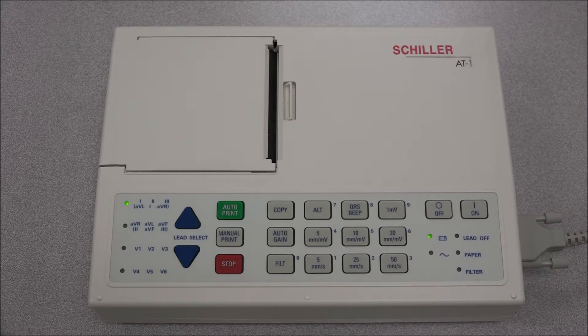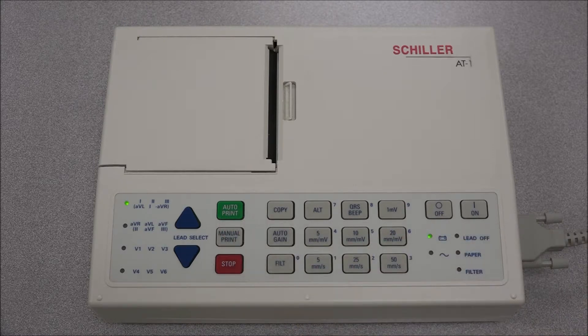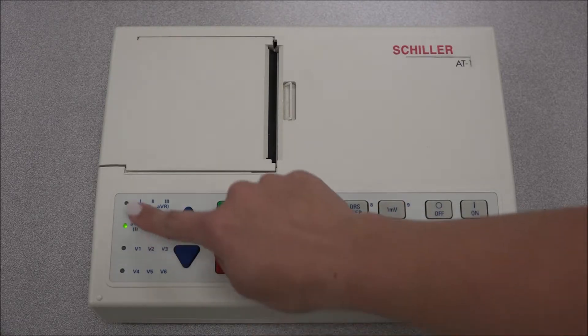To take a manual recording of a real-time ECG, press the manual start printout key. Because only three channels can be printed at a time, the lead group being printed can be changed by pressing the up or down arrows, and the LED lights will indicate which lead group is selected.